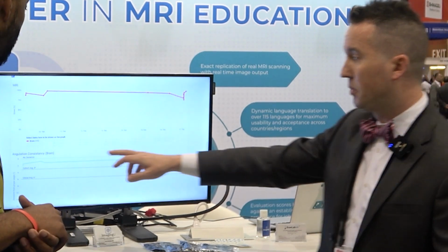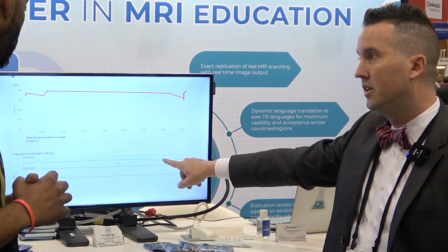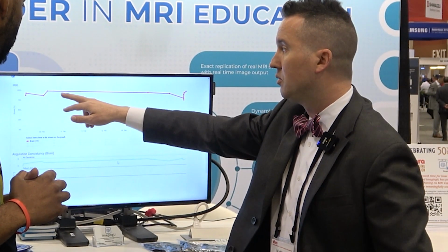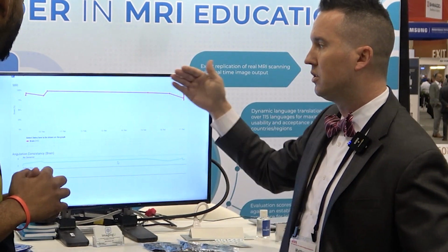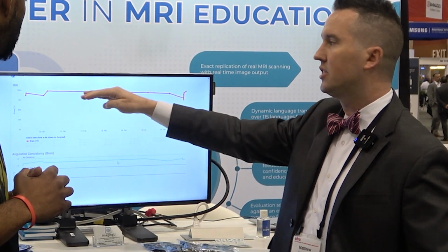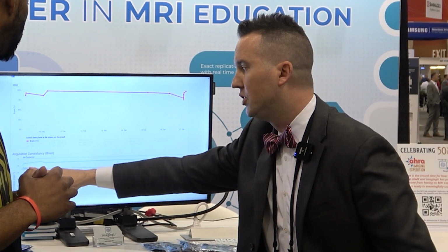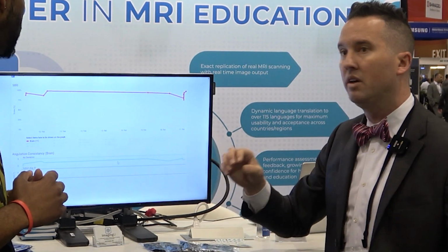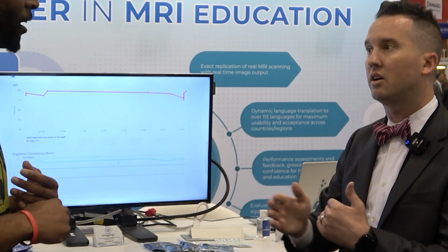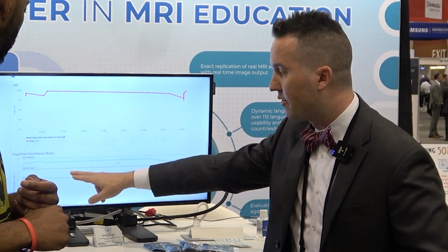Right. And so if the person was perfect to the ScanLab angle, then they would have no deviation. For a brain, this is amazing actually. We can now start to separate individual skills from not just being so vague as a high or a low ScanLab score. Now we're able to tell your deviation, and we'll come out with your slice coverage. Do you constantly overscan? Do you constantly underscan? And we have our global average.